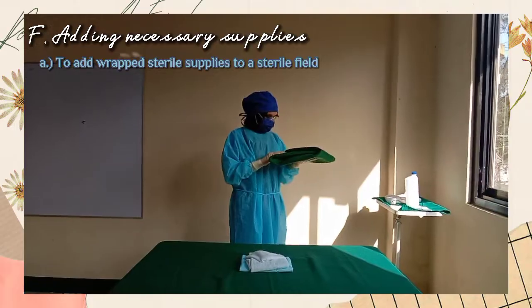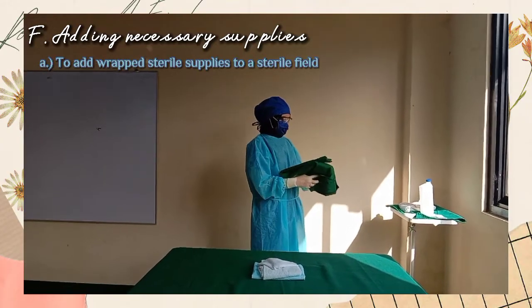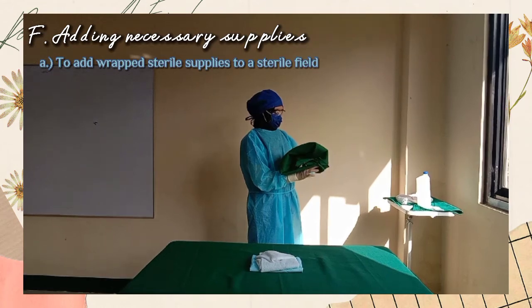Hold the wrapped item in the dominant hand, with the top flap opening away from the body. With the other hand, reach around the package and unfold the top flap and both sides, to prevent touching the inside surface of the wrapped item.